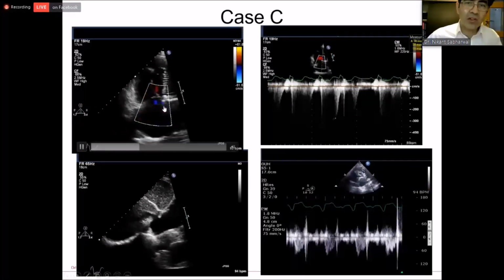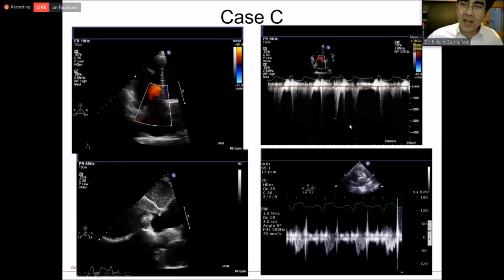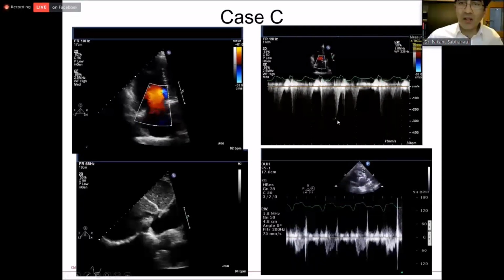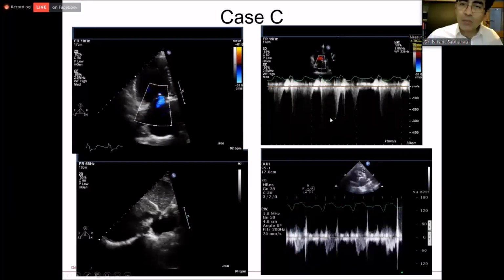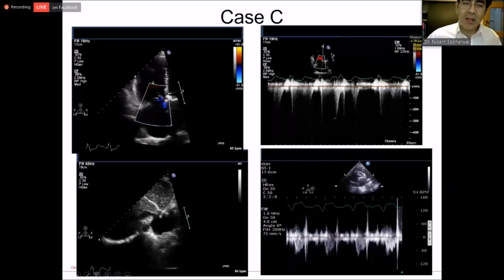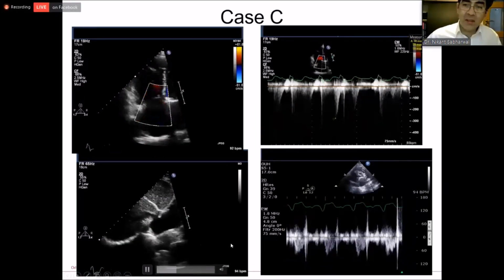Of course, there's tricuspid valve regurgitation. The TR velocity in this patient is more difficult. This is more of a real-world case. It's difficult to know exactly where it is. We could give saline to augment the Doppler flow, but in this case, we were pretty happy to put it about here. It's in the intermediate range. It's more than 2.8. It's definitely less than 3.4. Her IVC is not dilated, and it definitely collapses very nicely.